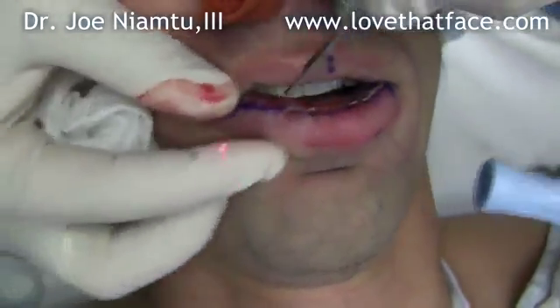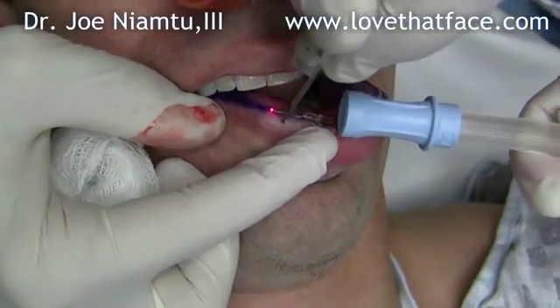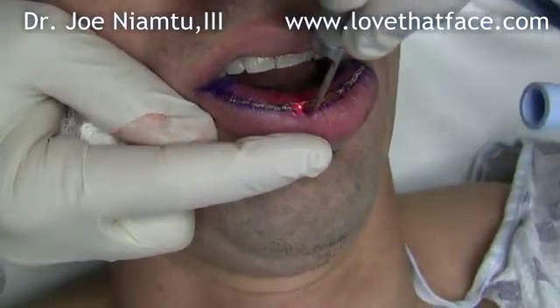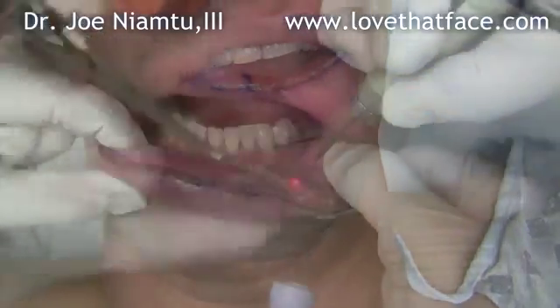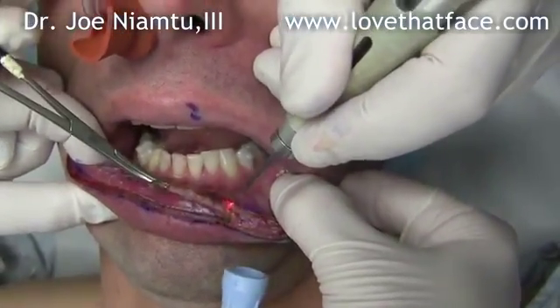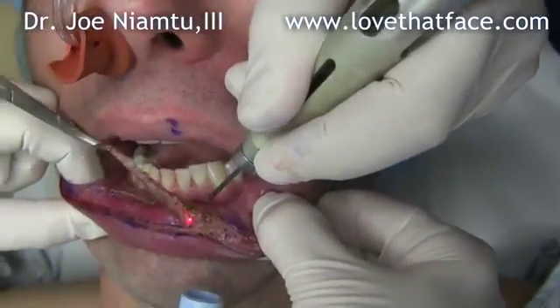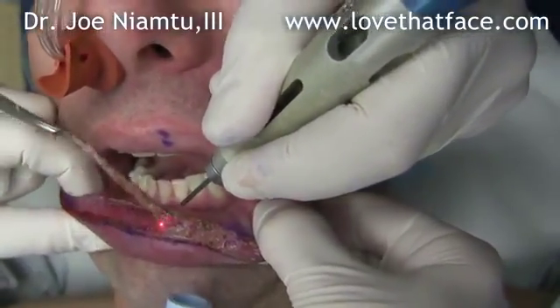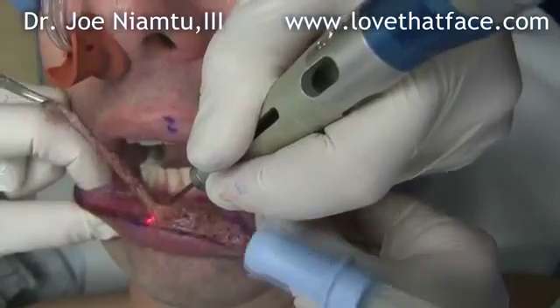This is really very similar to blepharoplasty. Once we make this incision, we'll remove this ellipse of skin. Everybody knows that the lip is a very vascular structure, and the fact that there's virtually zero bleeding here is notable. Just like blepharoplasty surgery, the incision is completely bloodless. Now we're going to be removing some of the extra mucosa, and depending on how much reduction is needed, we'll sometimes take some of the deeper tissue — the muscle and even the salivary glands. You can see how nicely this comes off with the laser.